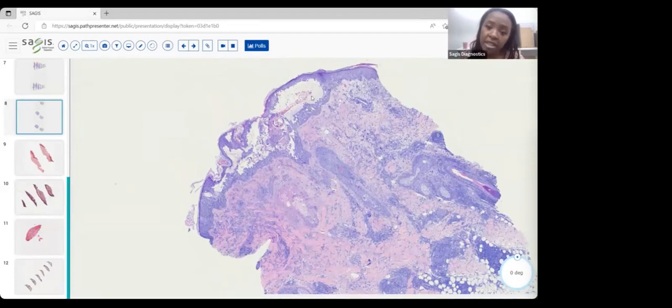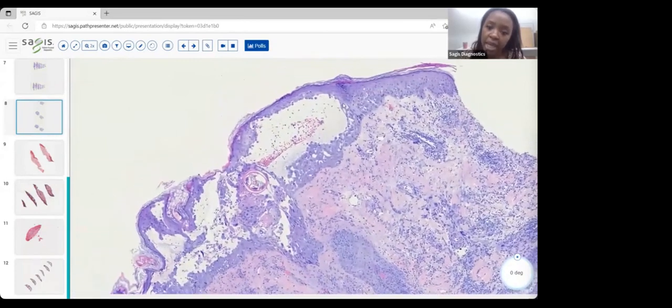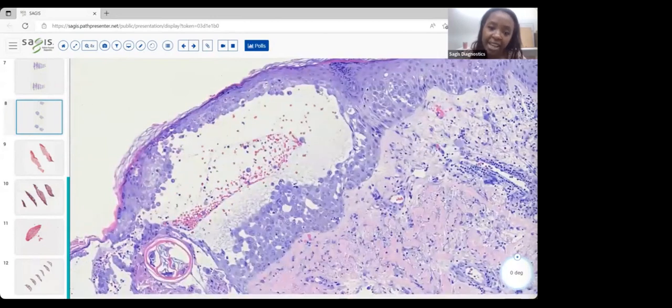Even when you have a vesicle, of course, you may not get such wonderful acantholysis and the 3 M's, you know, you may not have such a beautiful pattern immediately obvious. So you want to take a look at the edges of any vesicle to have your best opportunity to find this kind of cell. So always take a good look at the edges of the vesicle, and certainly that transition from involved epidermis to less or uninvolved. Okay.